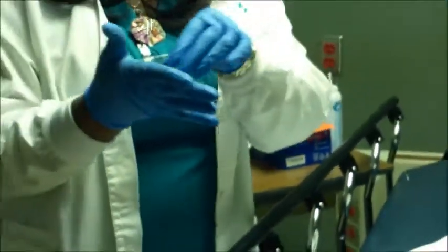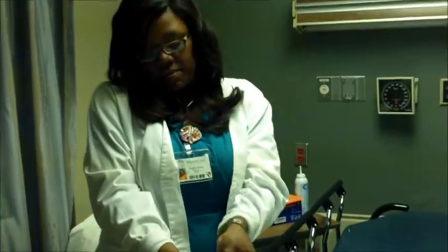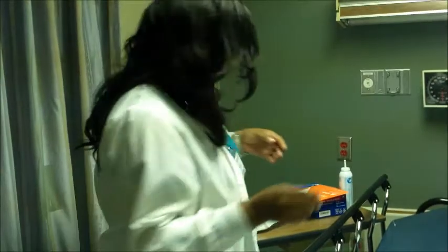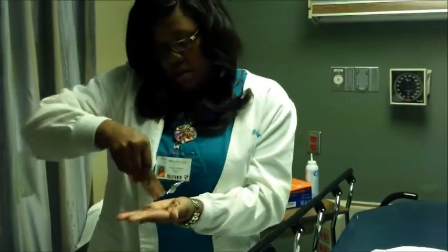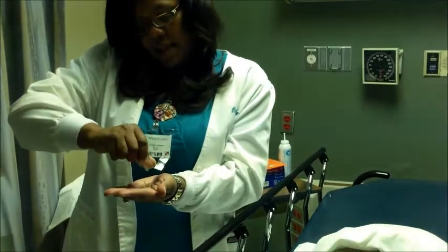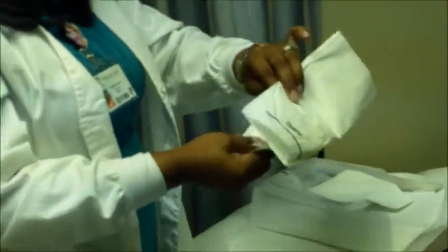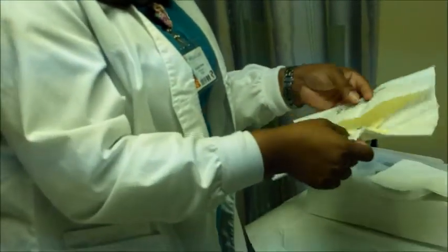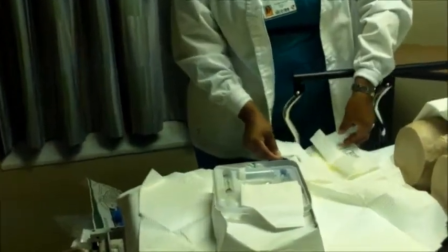Okay. Now, my hands are considered dirty, so I'm going to make sure I remove my gloves like that. Now, I have some antiseptic gel hand sanitizer. I want to open it and sanitize my hands prior to putting on my sterile gloves. I have my gloves, and I don my sterile gloves.